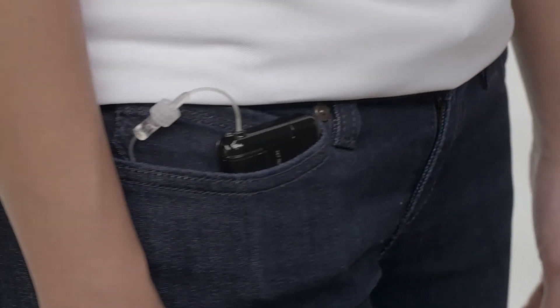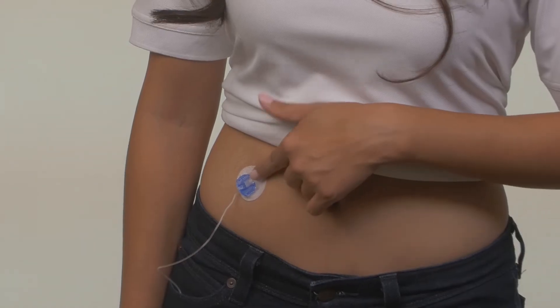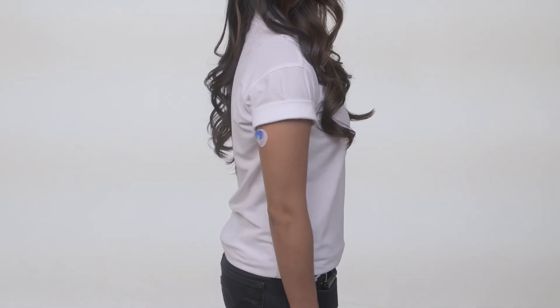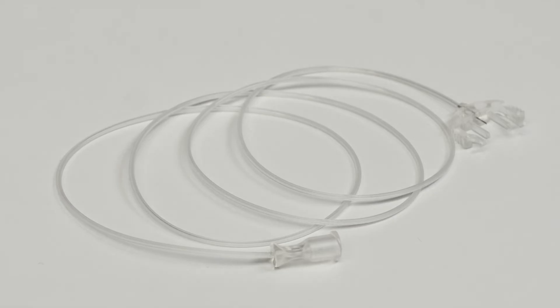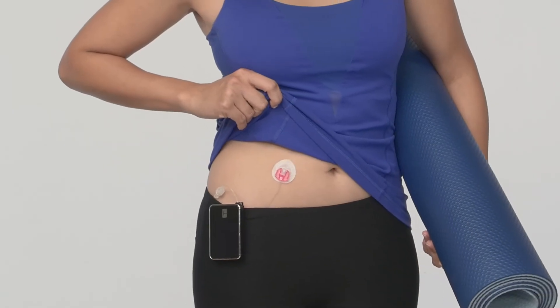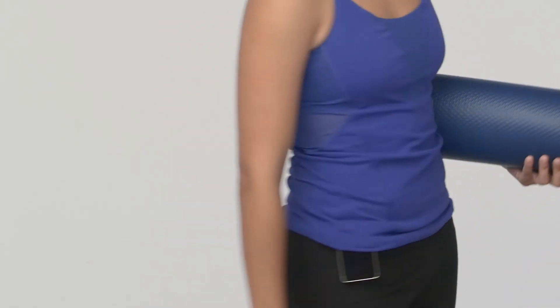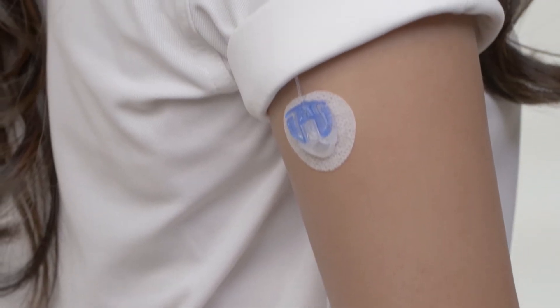When selecting tubing length, think about where you plan to wear your pump and where you plan on inserting your cannula. You should discuss cannula site options with your health care provider to find the sites that best meet your needs. It's important to rotate your insertion sites, so you may find it helps to have different tubing lengths. For example, if you have your set on your abdomen and your pump clipped to your waist, 23-inch tubing may be enough. But if your pump is in your pocket and your set is on the back of your arm, you may want longer tubing.